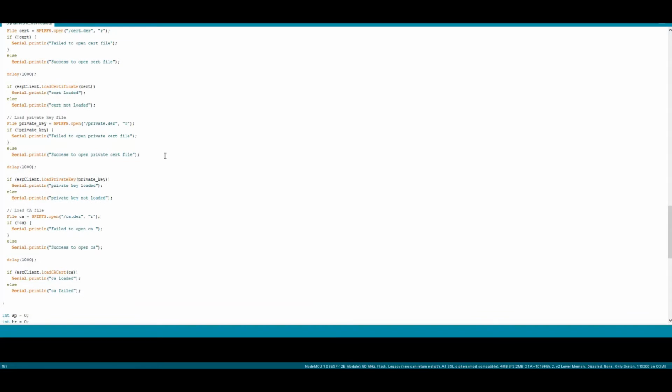The data generated in real time from the microcontroller is also stored in real time in a NoSQL database called DynamoDB so that the data can further be used for analysis and processing, which could be a crucial part in the upcoming modules of our project.